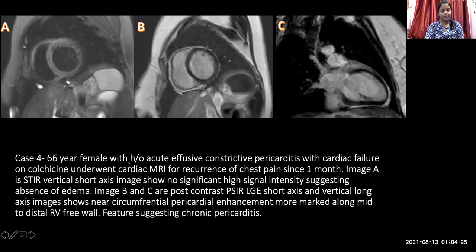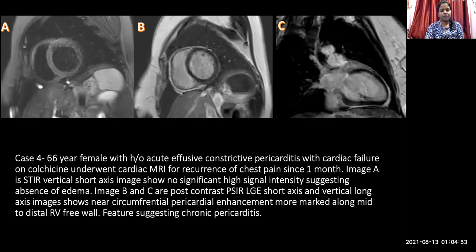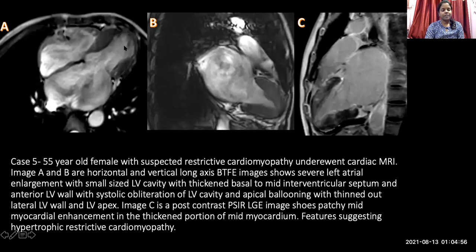A 66-year-old female with a history of acute-on-chronic constrictive pericarditis presenting with cardiac failure on colchicine treatment underwent cardiac MRI for recurrence of chest pain over one month. Image A is the STIR image showing no high signal intensity, suggesting absence of myocardial edema and indicating a chronic event. The B and C post-gadolinium enhancement images show circumferential pericardial enhancement, more marked along the right ventricular free wall, suggesting chronic pericarditis.